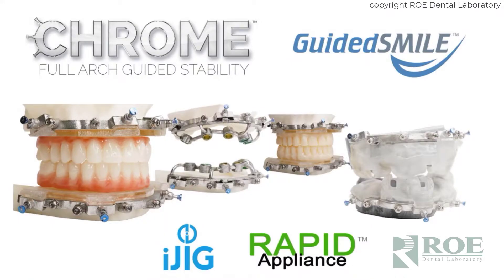This quick video will share the steps of completing a Chrome Guided Smile case on a dentate patient, single arch — in this case, a maxillary. Chrome Guided Smile fundamentally changes full mouth implant surgery. Chrome's immediate protocol utilizes superior industry-leading metal fixation, floating metal guide technology, excellent visualization and irrigation design, and is much less invasive than other guides. Chrome also offers an easy-to-convert final prosthetic protocol and the most advanced technology and technical support in the industry.